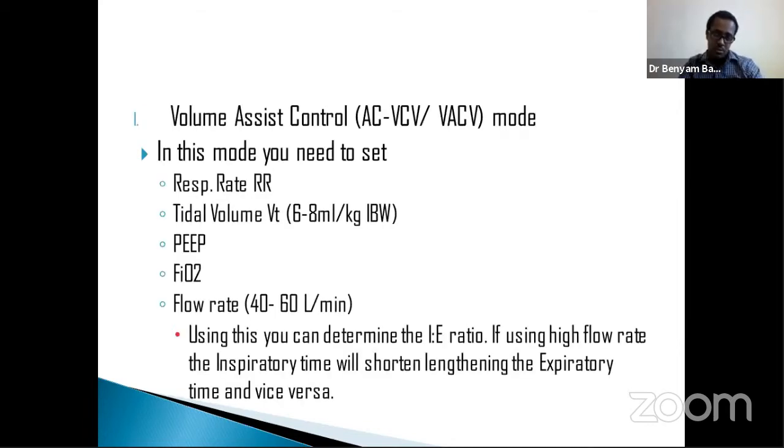There are different modes depending on the generation of the mechanical ventilator or the year it was produced. But mostly, those mechanical ventilators always function within the parameters I told you earlier. That is, there are two ways of delivering a breath, and three ways a patient could receive a breath. A patient could receive a breath via controlled, assisted, or spontaneous, and the breath will be delivered via volume or pressure. So the modes are combinations of those.